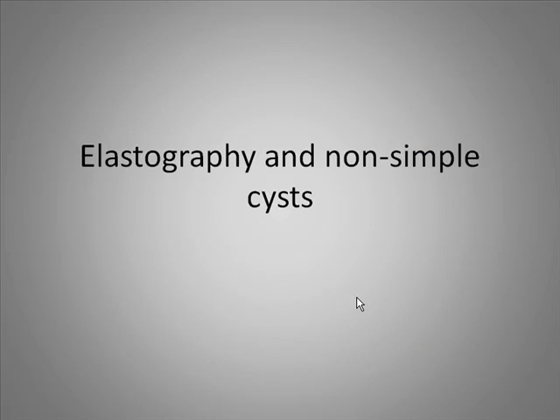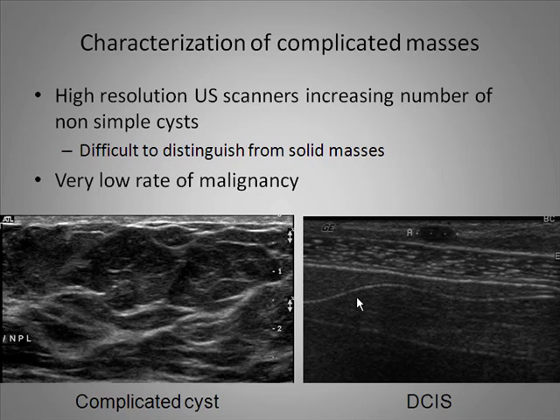What about non-simple cysts? These are an increasing problem in practice as ultrasound technology becomes very high resolution. More and more fluid-filled structures are displaying lots of internal echoes, thus appearing complicated rather than simple. A lot of these go to aspiration, and if we had a tool to distinguish these hypoechoic masses that are complicated cysts from actual solid masses, a lot of intervention would be spared.